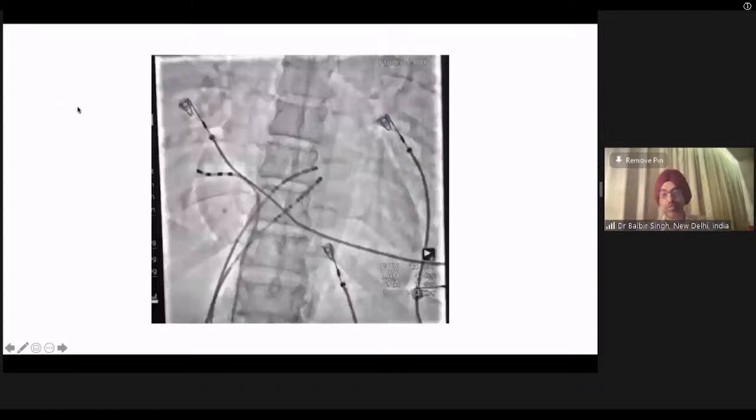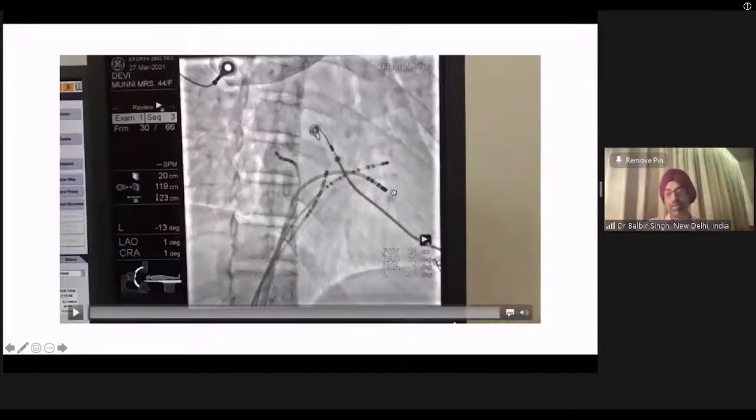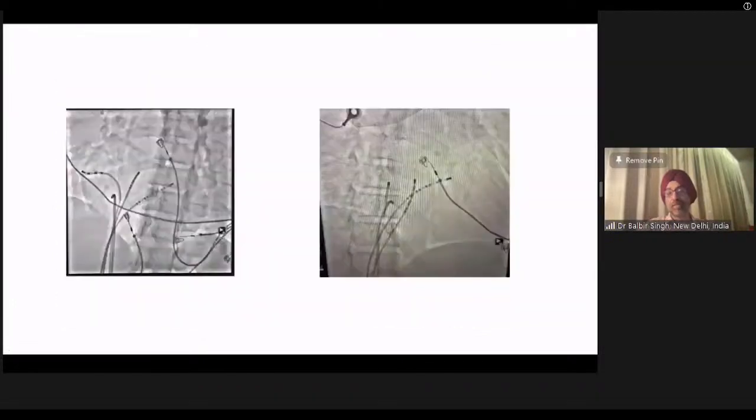Now, this is to show the catheter placement. So we have one in the CS, we have one in the high right atria, and a decapolar in the His, starting from the right bundle to the proximal part of the His. And the pacing catheter is on the distal part. We don't pace from the RV apex, pace distal to the right bundle. So this is the catheter placement.